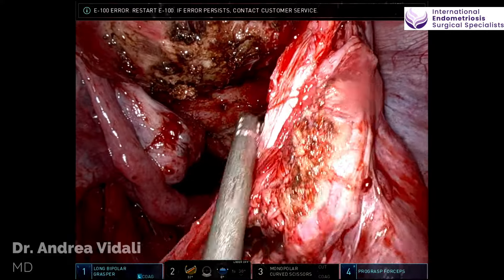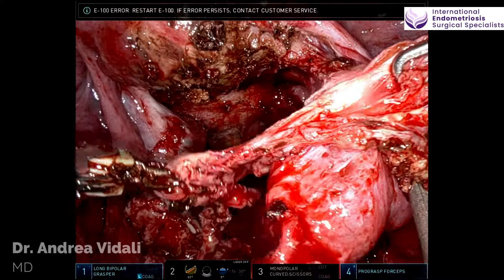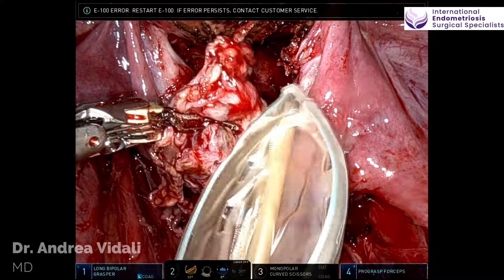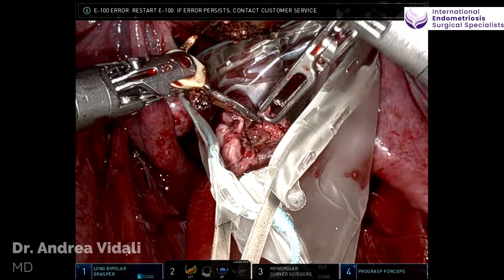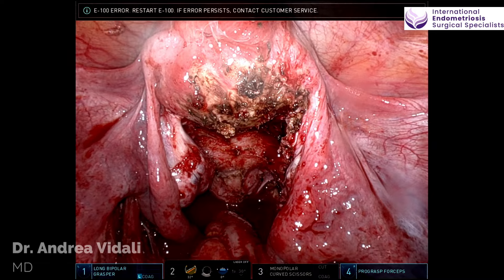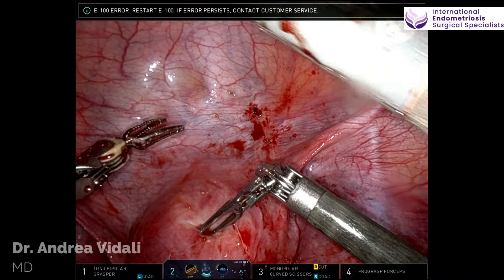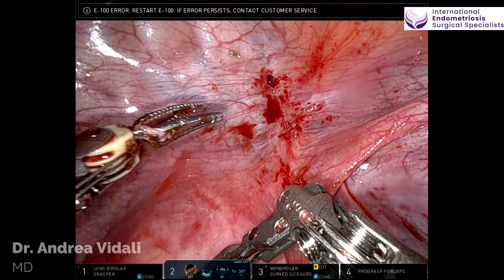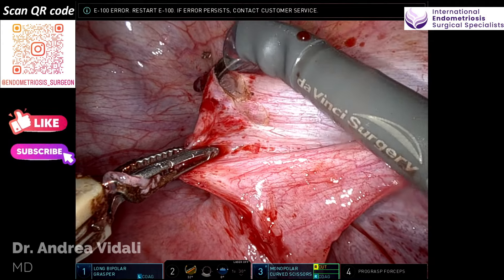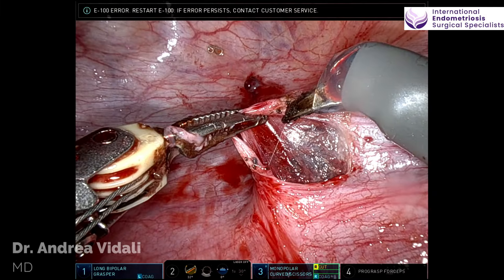Let me correct myself — it's a type 1 endometrioma. Type 2 is the easier one to actually remove. Moving along with the surgery, we could see that there was a lesion anteriorly on the bladder serosa that dug a little bit deeper, and we proceeded to removing that lesion as well.